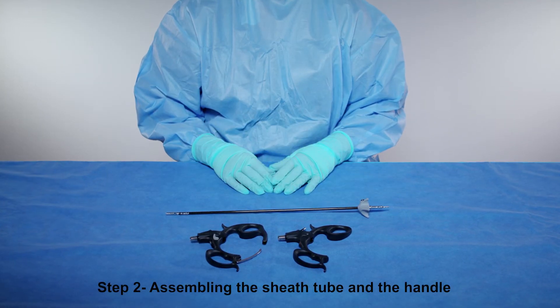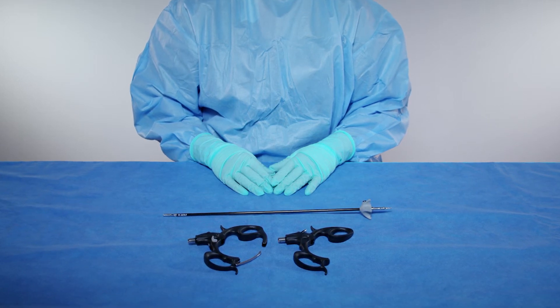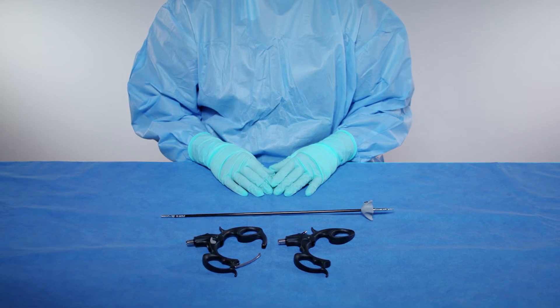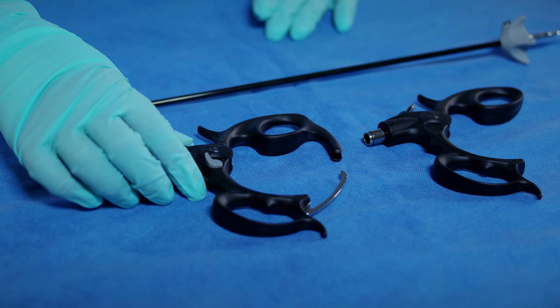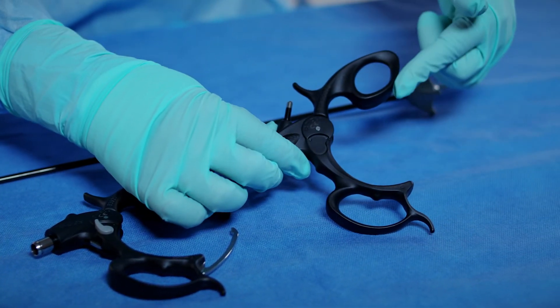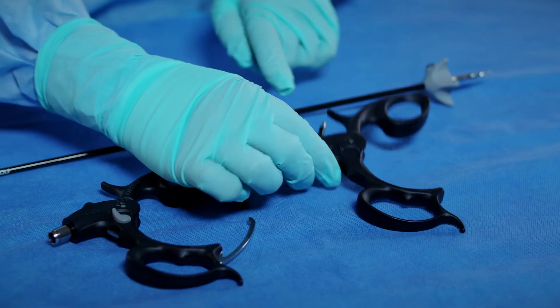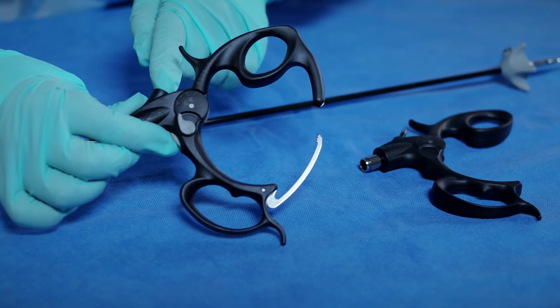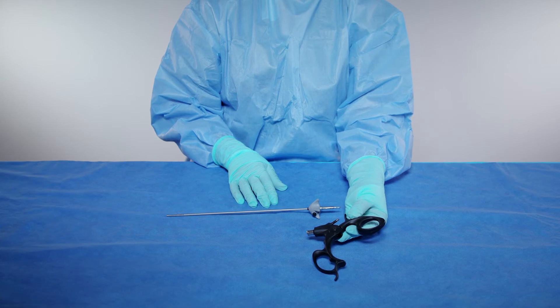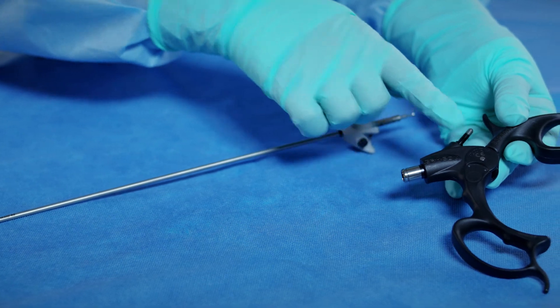Step 2: Assembling the sheath tube and the handle. Select the handle with the appropriate functionality for the instrument — for example, ratcheted or non-ratcheted, with a high frequency post or without a high frequency post. Please note that as a precaution, non-insulated sheaths will not fit handles with a high frequency post.